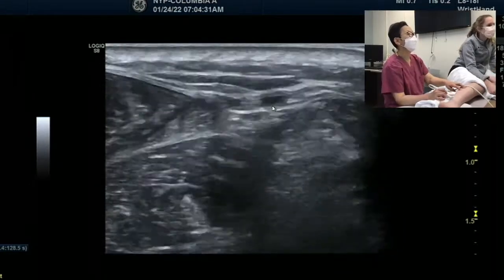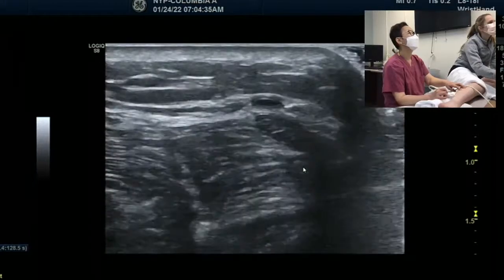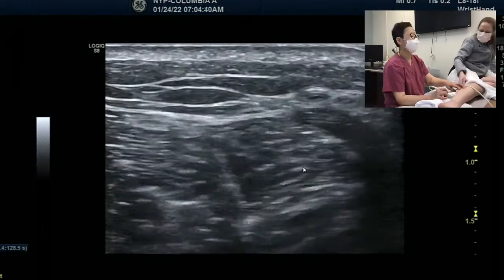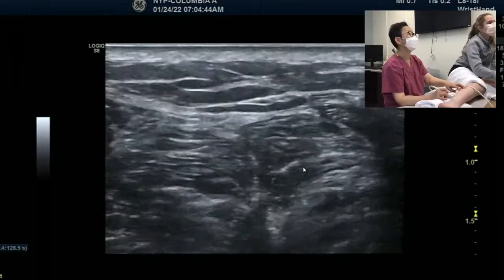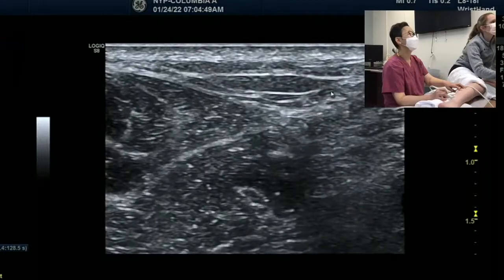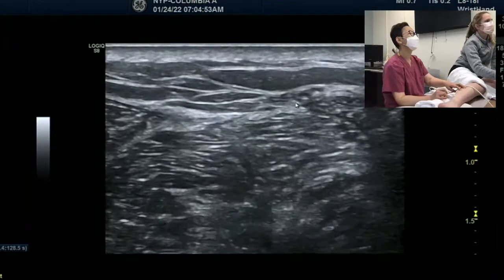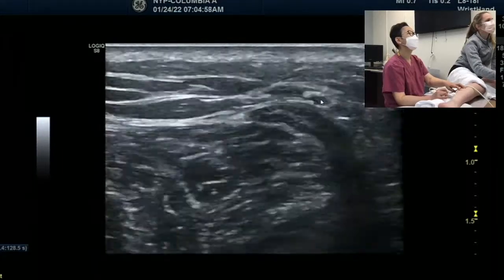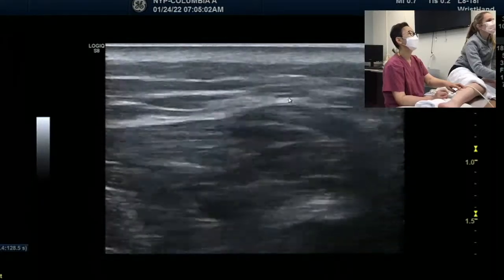Okay. Boom. We are going up, up, up. The sural nerve is still there. Did you see it? Yeah, it's going deep, but now look at where the sural nerve is, which you missed while you were thinking. I see very well. Yeah, that's the sural nerve, right? And then I'm going to go on continuously, more superficially it's going, right? Superficially, superficially. That one. I'm helping Princess Debbie.